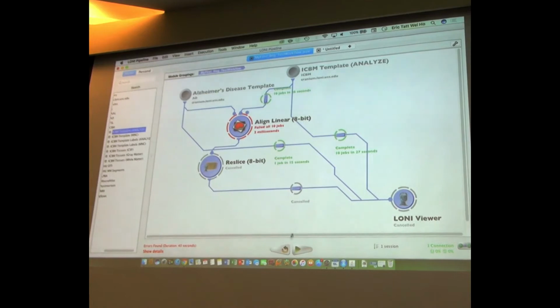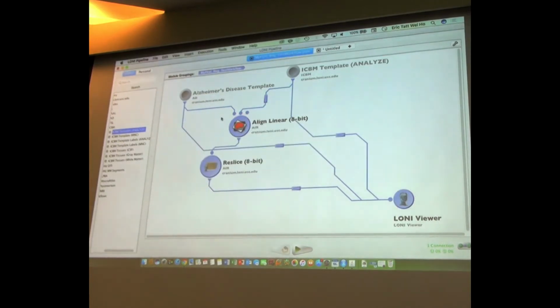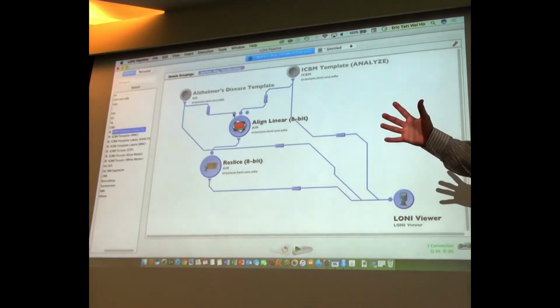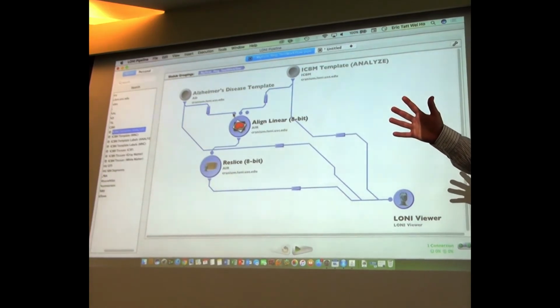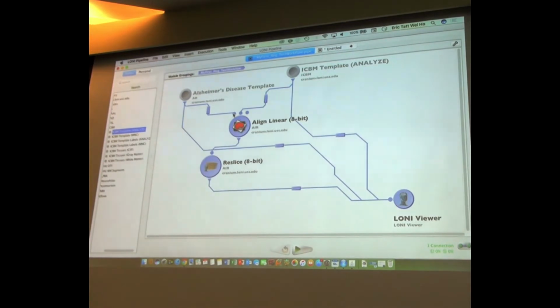The way to fix that is to reset that workflow and go back to doing it right. And doing it right indicated that I have to have this smart line here because it fixes my long file name problems. Okay? See? So let's give this thing a try now. I believe that's going to work, but we shall see.